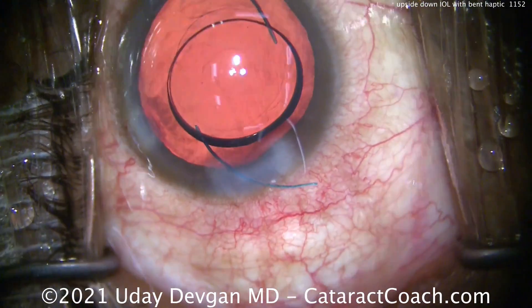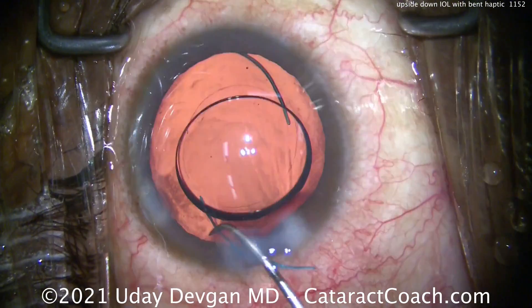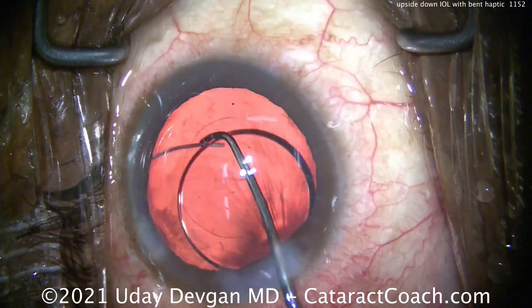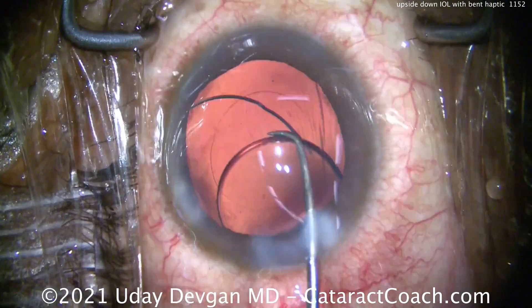Now we've got it flipped to the correct orientation. It's the anti-S — remember, you don't want the haptics to ever look like the letter S. Now we'll put it in the eye; the haptics are not in the bag yet. Let's get that dialed in a little bit better.